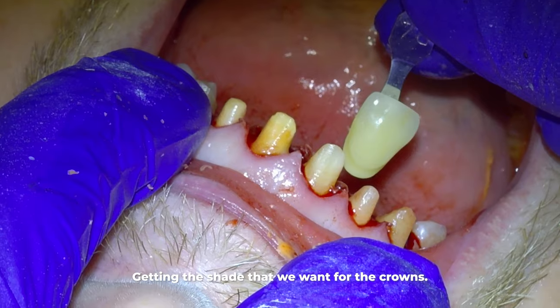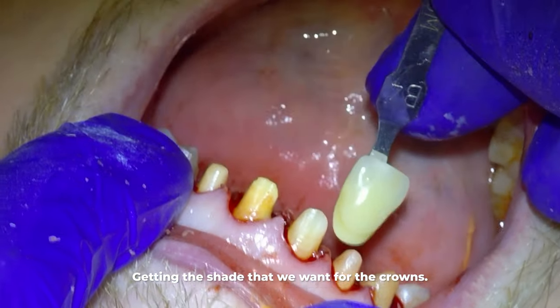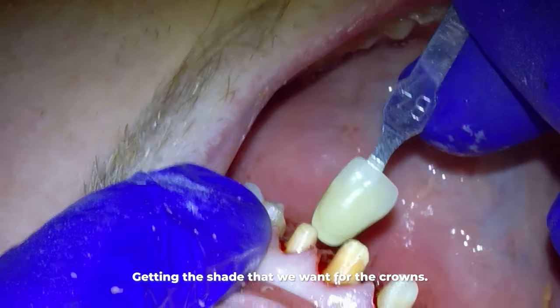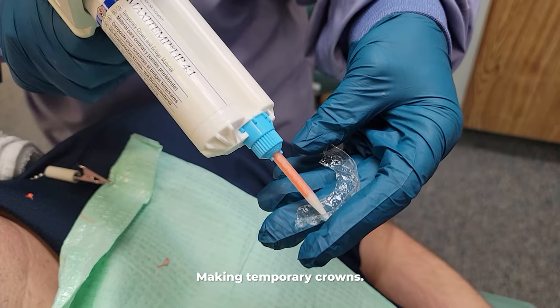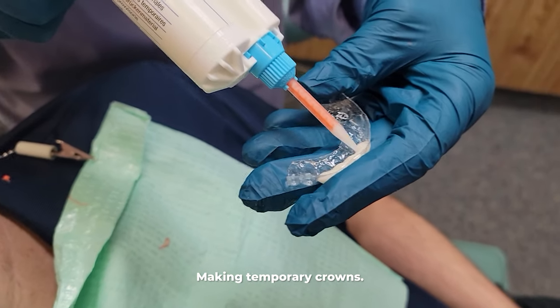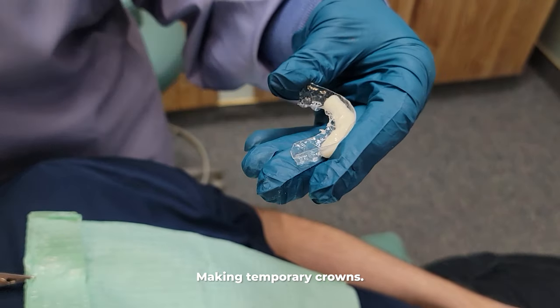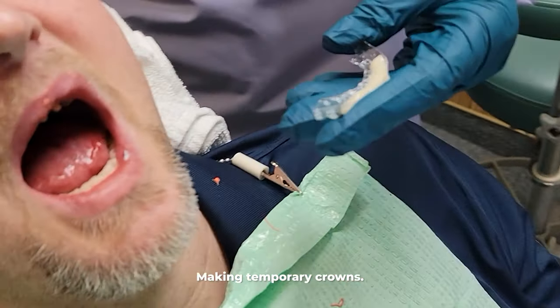But when you do six, they can be a little bit lighter than the rest of the teeth. That's why we were trying to get just as much whitening as we could from the teeth whitening process. For now, we make temporary crowns by using a plastic template that we made from impressions we took before we ever drilled on the teeth, so the temporary crowns will be fashioned after the original teeth.